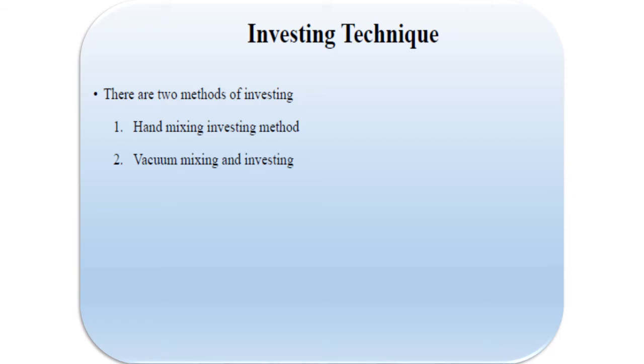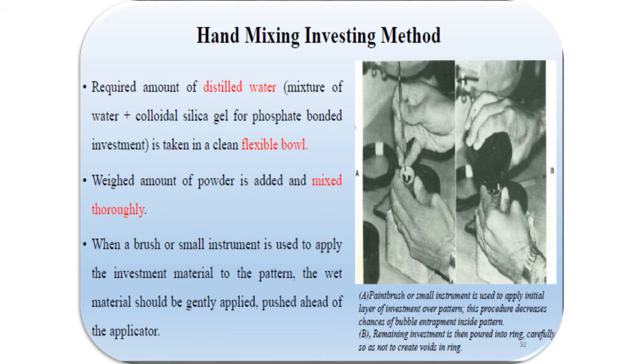Whereas the hand mixing investing method is very cost free, we don't need much expensive equipment for mixing the investment material. That also works out well if all the principles of the investing technique are followed. Whichever technique we follow, whether it is the hand mixing technique or the vacuum mixing technique, the final motto of the investing method is a void free casting, or a bubble free casting.